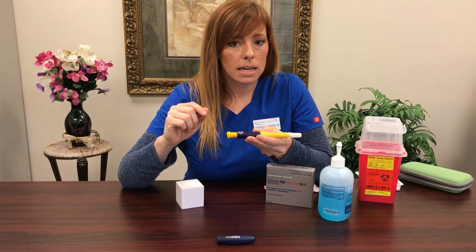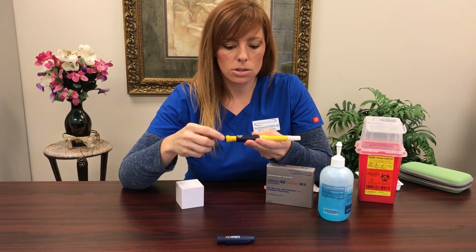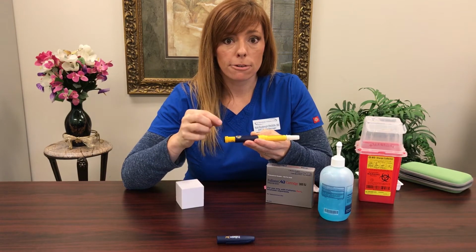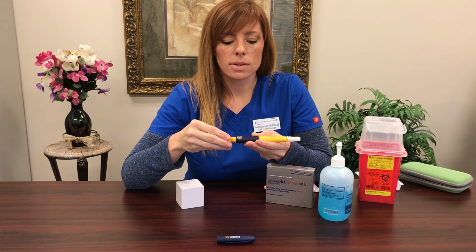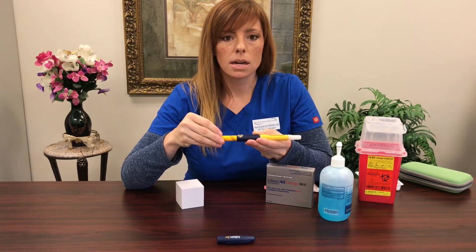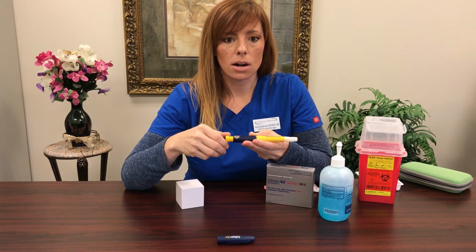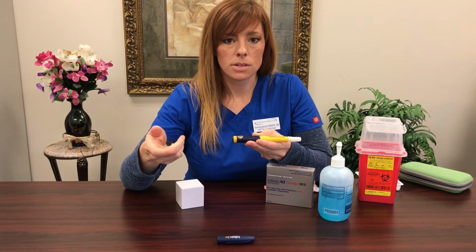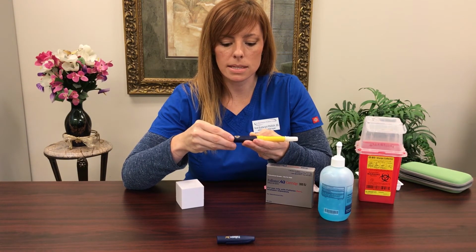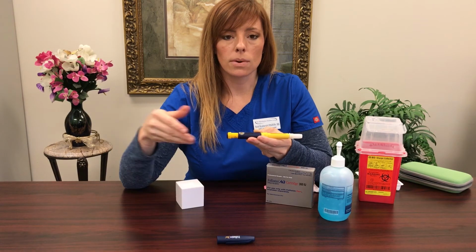Now, if I were to make a mistake and dial past my 225, you'll see a window with the number here. It's absolutely okay. For the Follistim pen, all you have to do is dial all the way up till it won't let you dial anymore, and then it will actually let you reset all the way down to 0 again. So we'll just start back. Let's find that 225. We'll go a little slower this time so we don't miss it, and we're there.